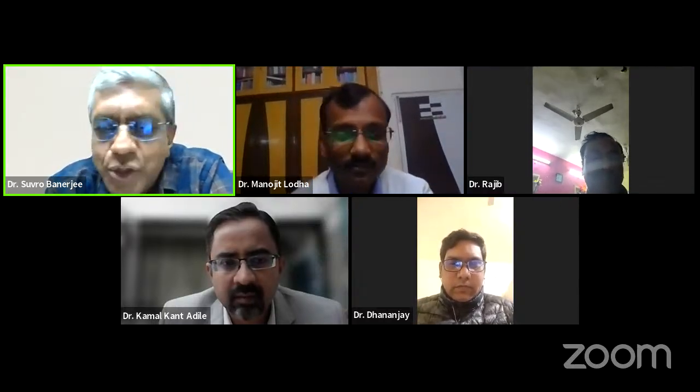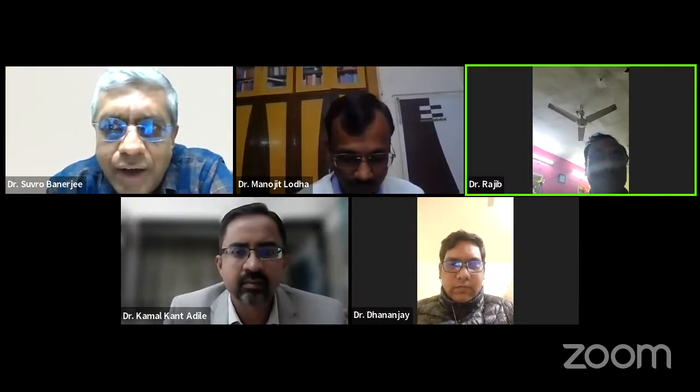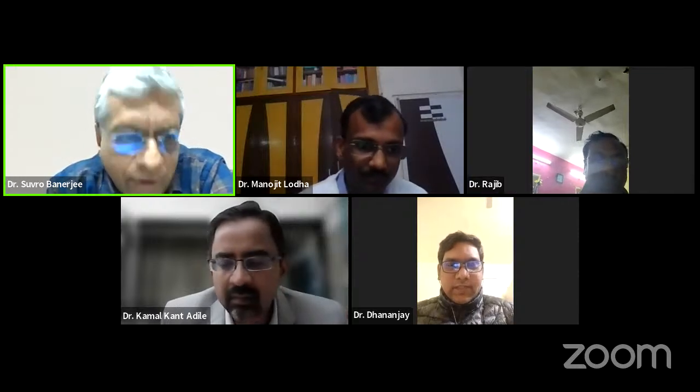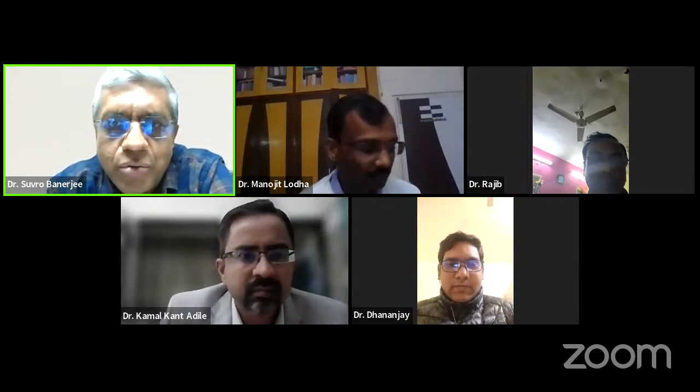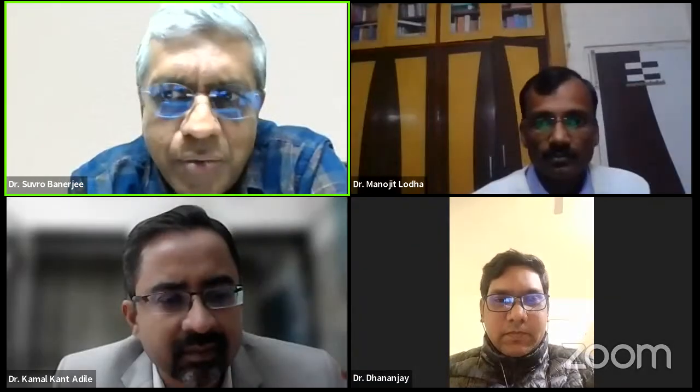I actually go for post-dilatation almost in all cases. Even in primary PCI, sir? In primary PCI also. I understand there is a risk, but I do not go to very high pressure. At least I do some post-dilatation, because otherwise there may be a lot of thrombus just outside your stent, and as it gradually resolves, there may be stent malapposition also.